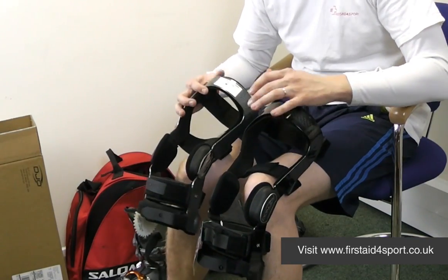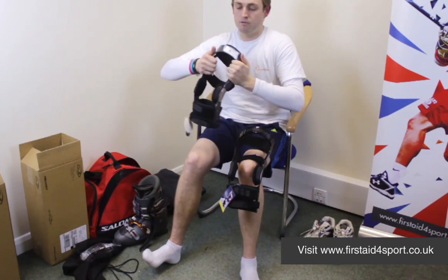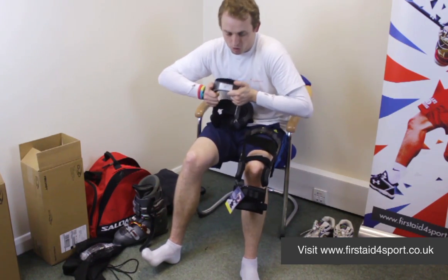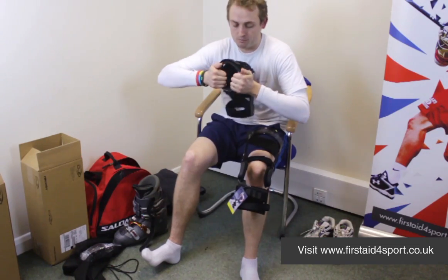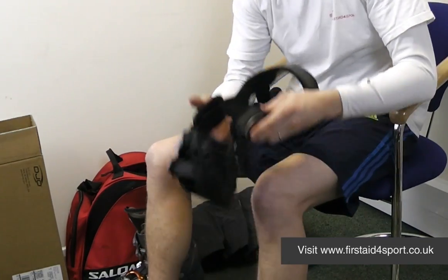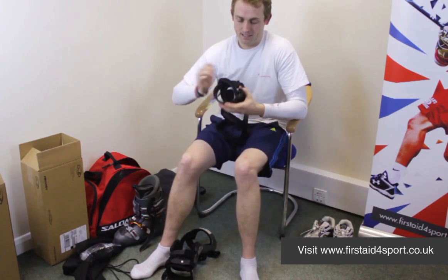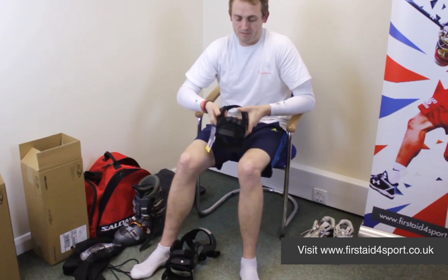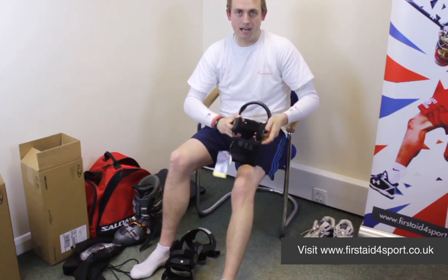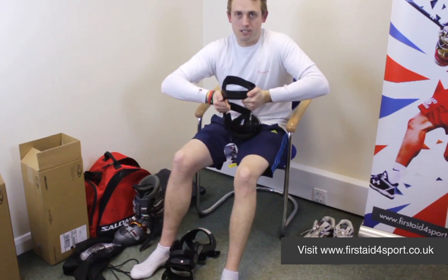The big difference comes in the frame, where the Armour — which is the grey motley frame — is aircraft grade aluminium and is very rigid and very strong with very little movement, which is a good and a bad thing. Whereas the Full Force has got a little bit more flex in the frame, which, although you want total support, having a little bit of flex does allow a bit more natural movement of the knee, but it's still a hugely supportive frame.